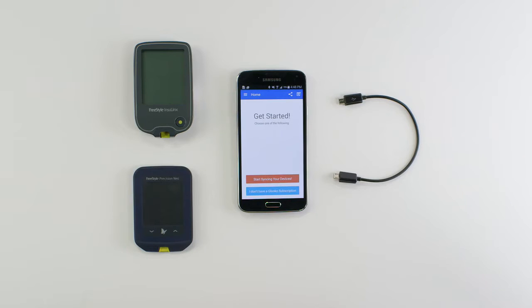Hey there, welcome to Gluco. Today I'm going to show you how to sync a freestyle USB blood glucose meter with the Gluco mobile app.